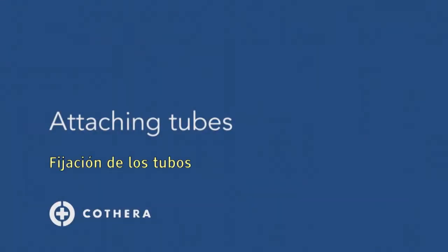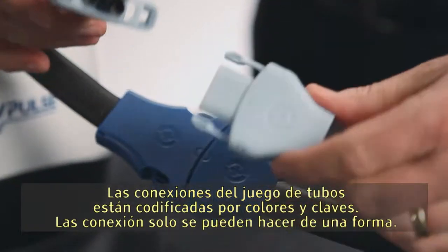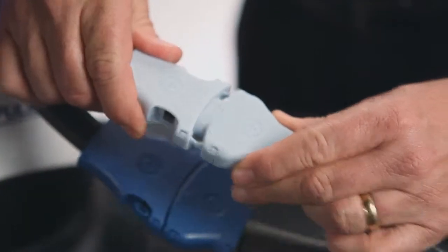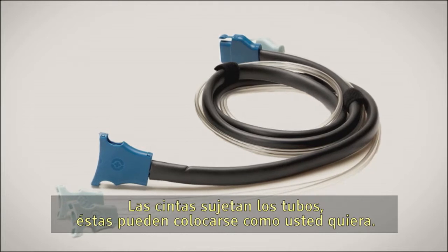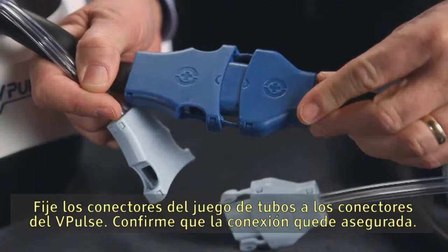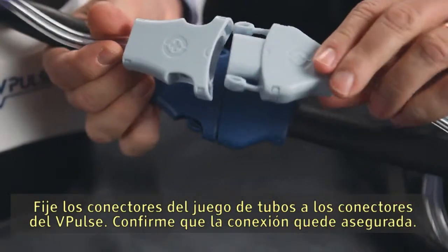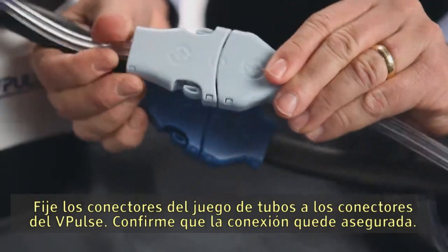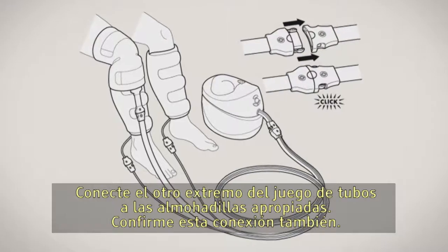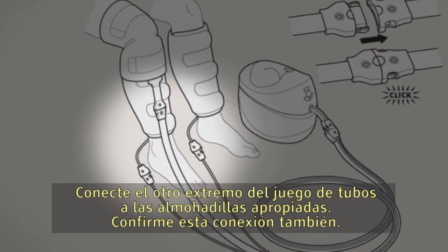The connections on the tubing set are color-coded and keyed — connections can be made only one way. The tubing is held together by straps that can be positioned as you choose. Attach the connectors on the tubing set to the connectors on the V-Pulse and confirm a secure connection, then connect the other end of the tubing set to the appropriate pads and confirm that connection as well.